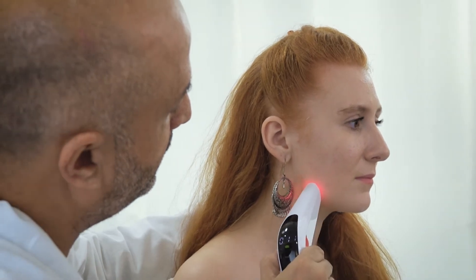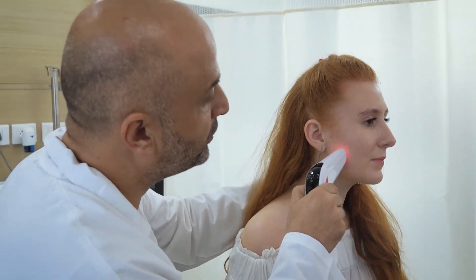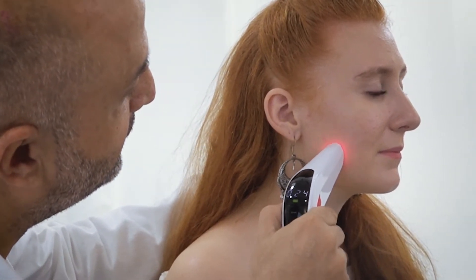Increase the intensity of the biostimulation until the patient feels a needling or prickling sensation. Do not keep the intensity too low or too high. Start moving Cura Laser back and forth or in a circular motion over the affected area of the jaw.